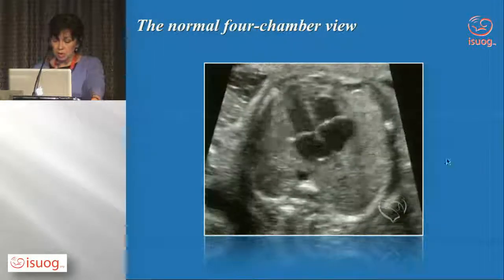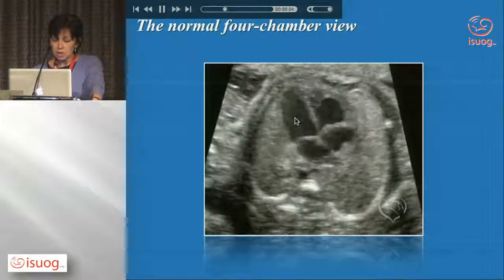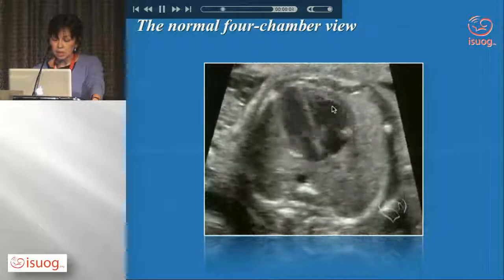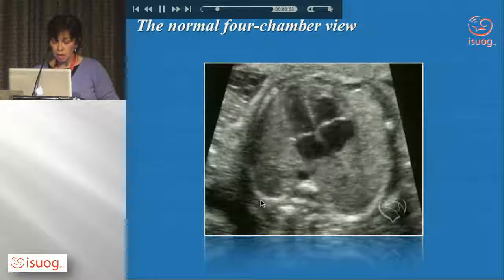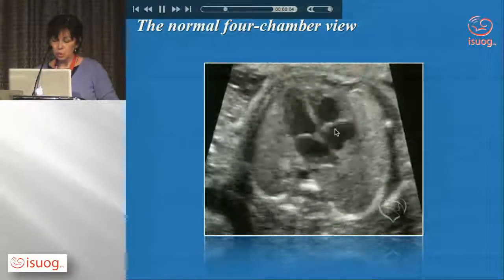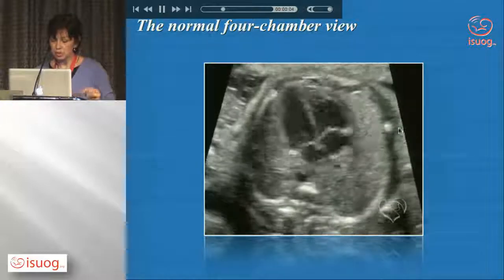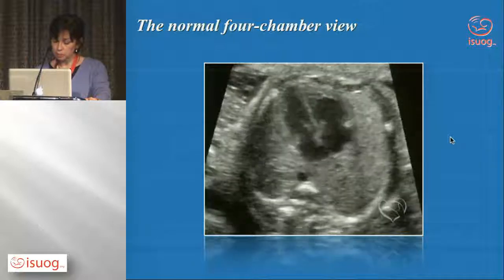This is the same as the clip. So good contractility: the heart squeezes everything in systole and opens in diastole. There is symmetry, right and left more or less the same size, and two valves opening and closing. And remember that you do need to see those valves opening and closing separately. Very important for the assessment of atrioventricular septal defect.